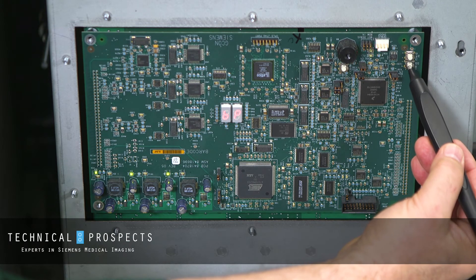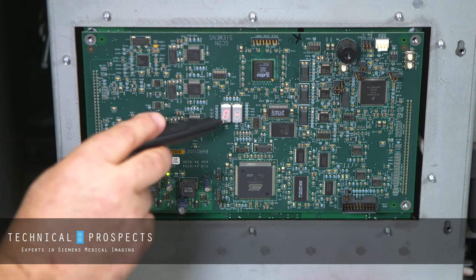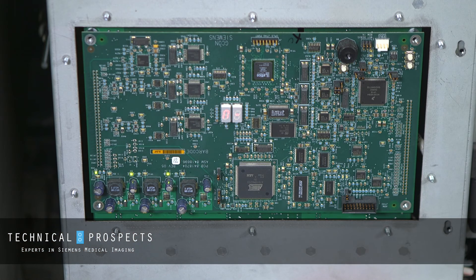We press S2, then S1 — that goes off. The display turns into an A-dash, and we hear the 24-volt mains fan turn on. We are now in manual mode.